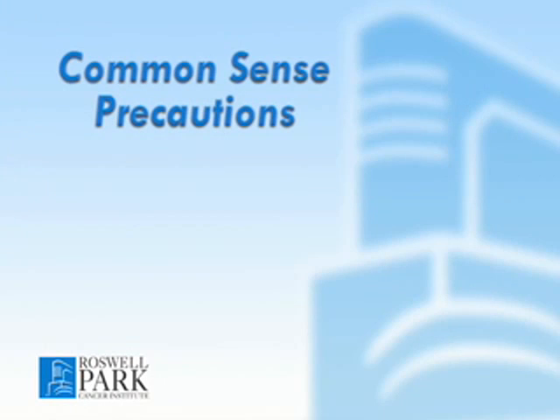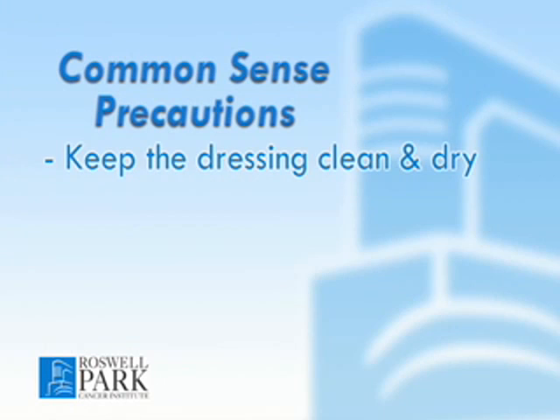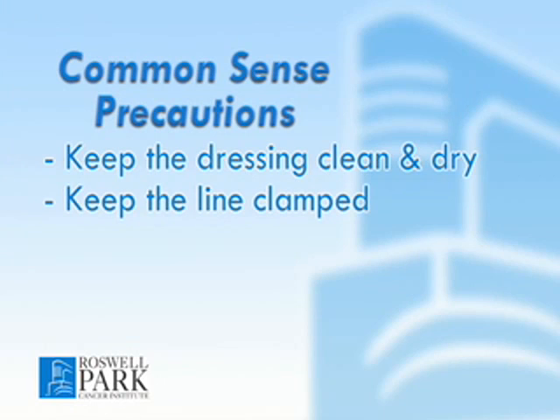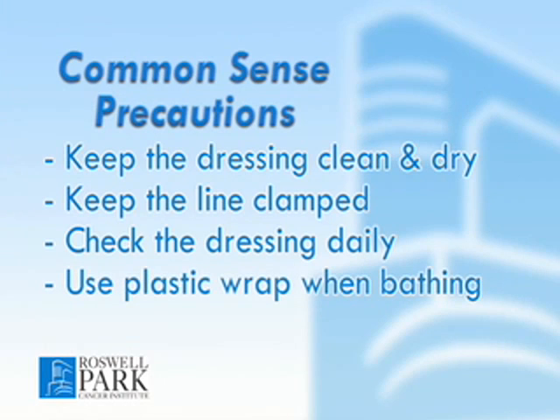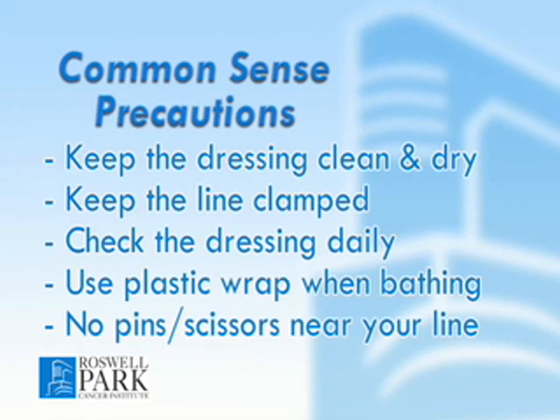Remember some common sense precautions to keep your line safe. Keep the dressing clean and dry. Keep the line clamped when not in use. Check the dressing daily to ensure that the dressing is undamaged and in place. Use plastic wrap to cover the line during a shower or bath. Never use pins or scissors near your line.